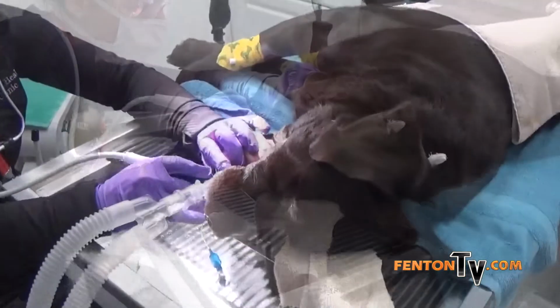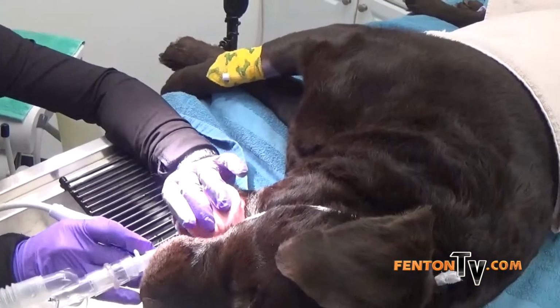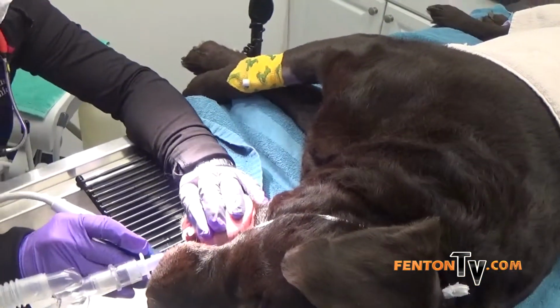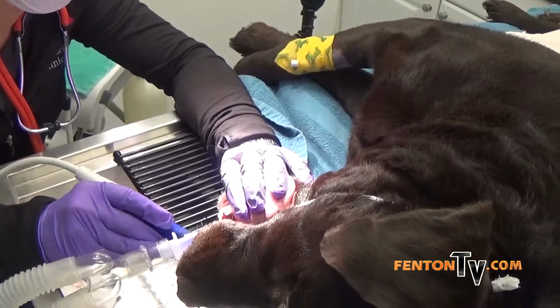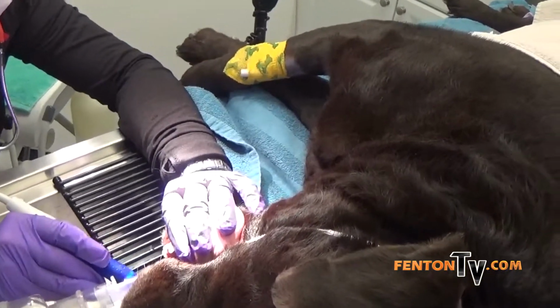We put in a catheter for every surgical patient because it allows us immediate venous access in case anything were to happen. We don't have to try and find a vein. It's already there. It's already ready.